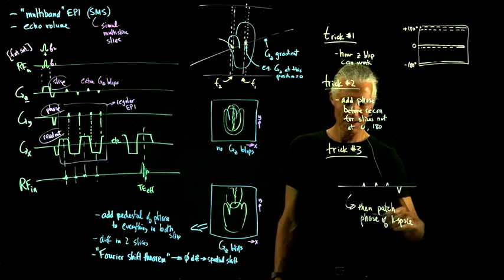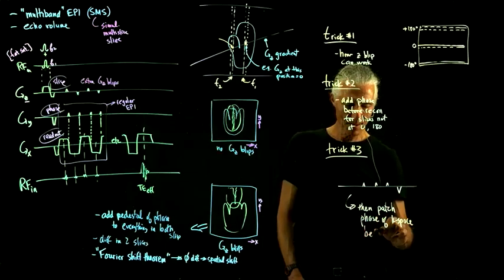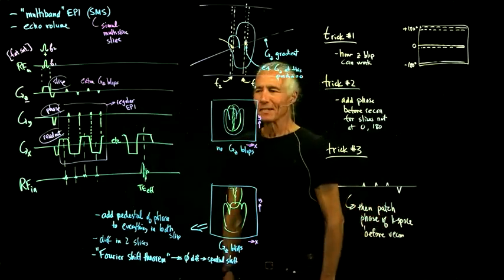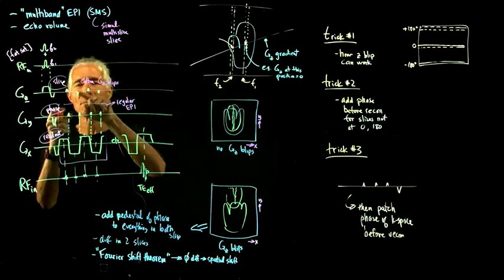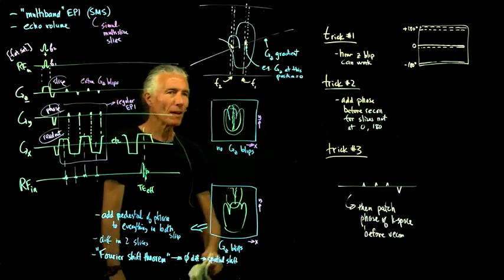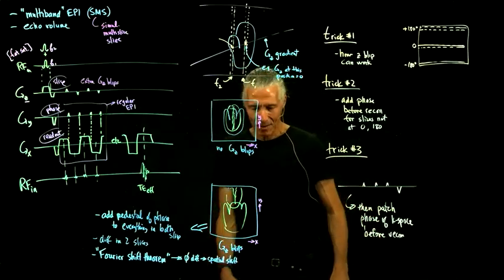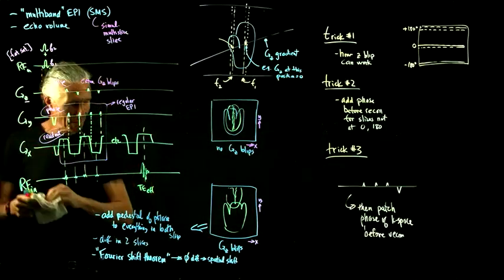So now you can see there's all different kinds of tricky ways of doing this before recon. Okay, so that's the pulse sequence. The actual pulse sequence will have 3 up or 4 up, and then 1 bigger down. And that will solve the problem of not killing our signal because we're wrapping up spin stripes in the z direction. But we still haven't said how we actually un-overlap the slices.